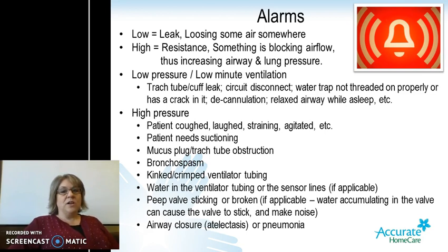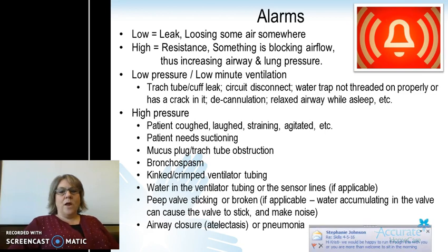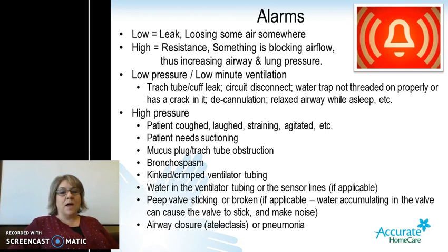If you see a low pressure or low minute ventilation alarm going off, it could be that the trach tube cuff has a leak around it, the circuit is disconnected, the water trap is not threaded on properly or has a crack in it, decannulation, relaxed airway while asleep, or something along that line. Regardless, the first thing we will do is assure the patient's safety, transfer them to the backup ventilator if needed, and then troubleshoot.